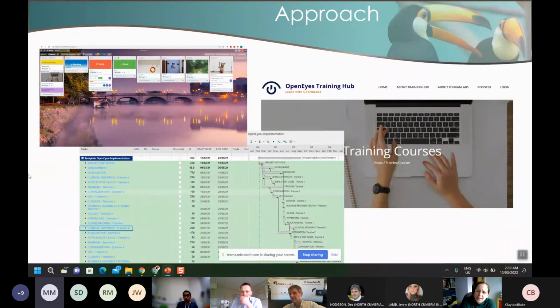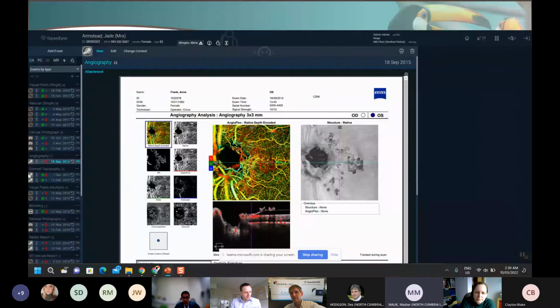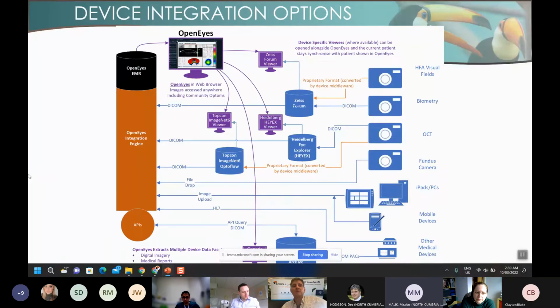Hi, thanks, Cara. Question about the interfacing, specifically the HL7 PAS interface. Can that be bidirectional? So could you send messages so that we could send it back to our PAS system?